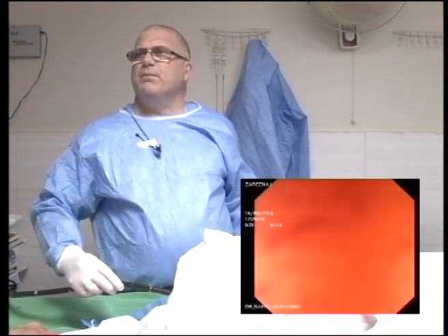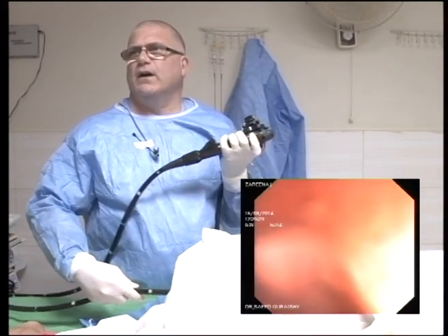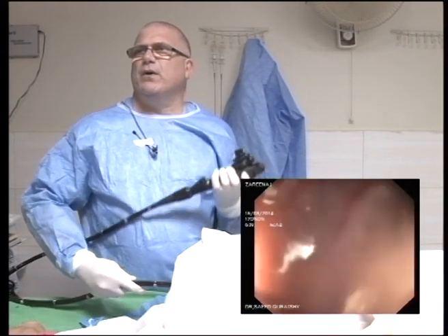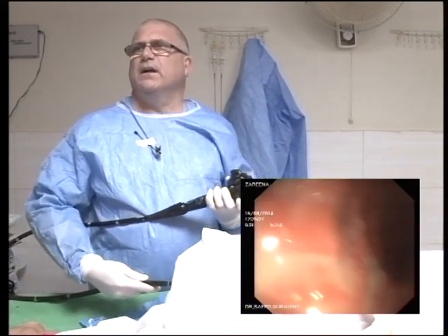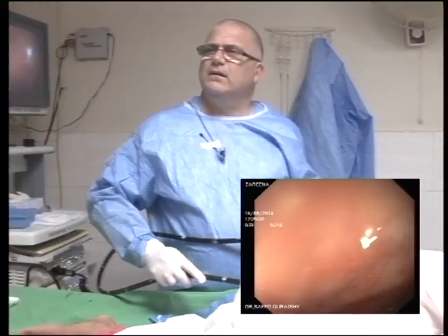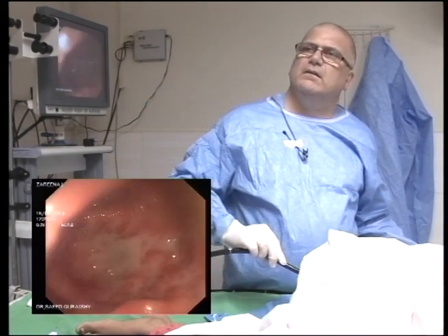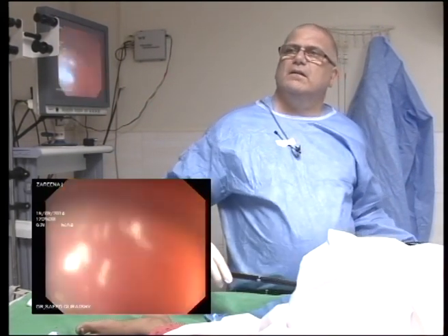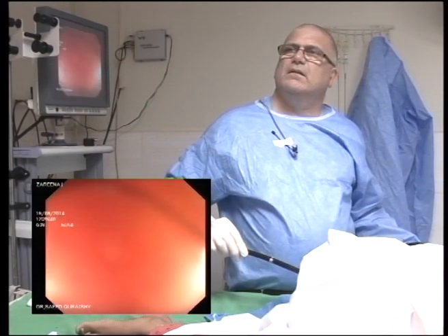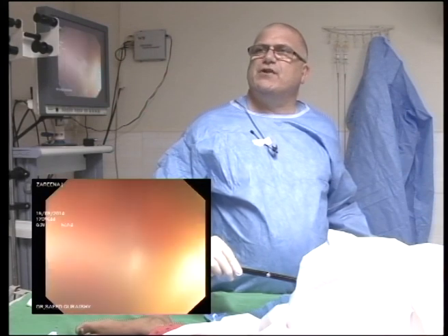So if you notice, compared to the guys when they've gone in, I've gone anti-clockwise straight off and now gone clockwise. I won't be going much further. You just give it a bit of a flush so you can see it much better than me. Can you give it a bit of a flush so that we can see it better, because it's not projecting very well.